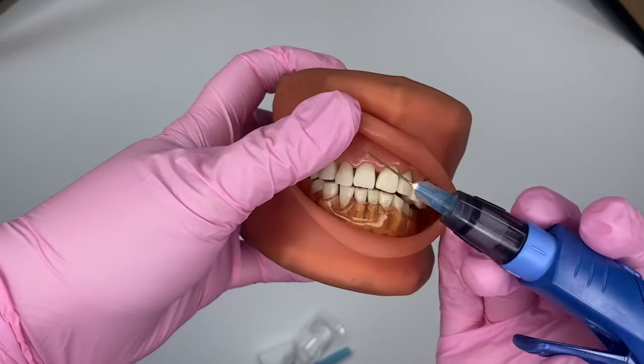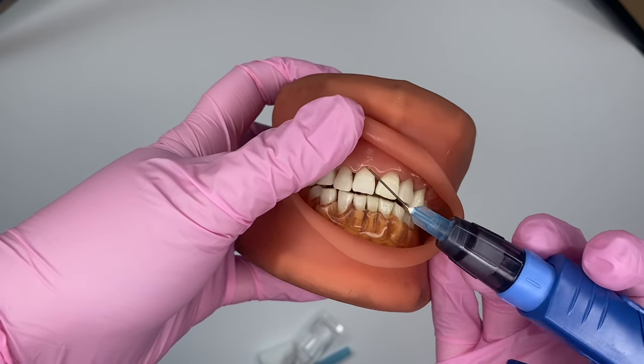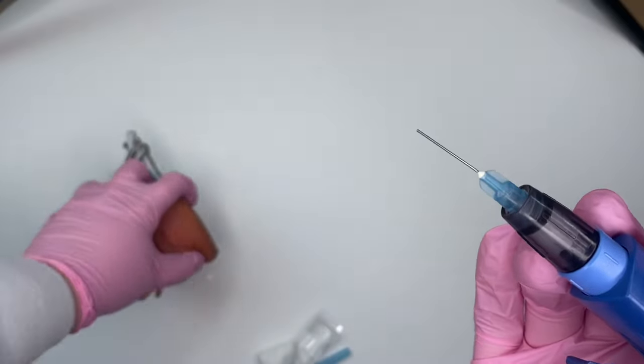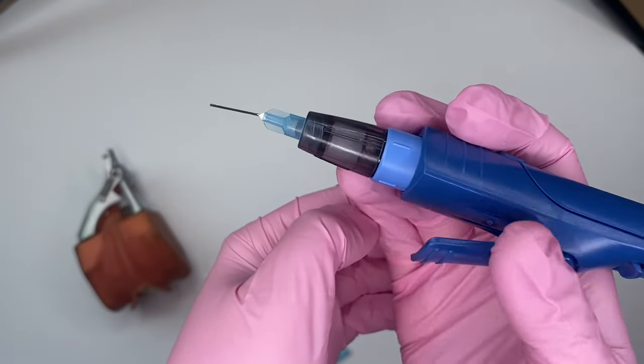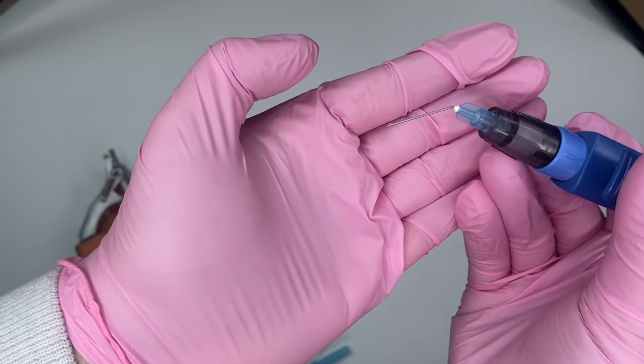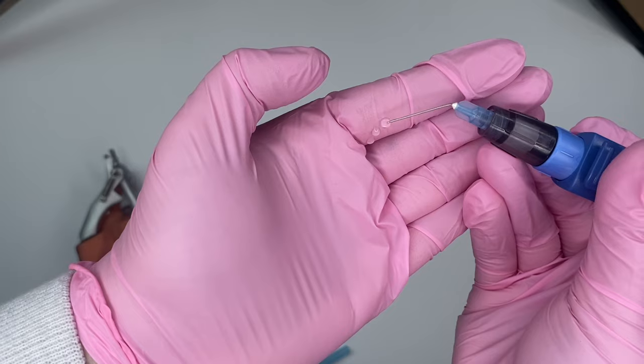Place it along the gum line for about 10 seconds, then enter the pocket - that'll take the edge off for the patient. To use this, you just use this little lever and click, and you'll see the anesthetic come out the tip. Just like that.